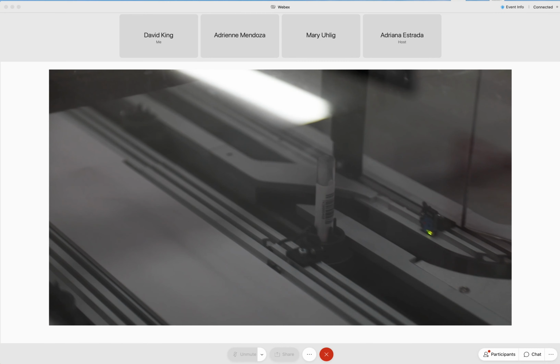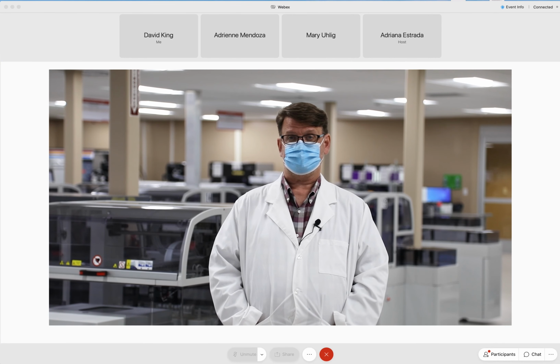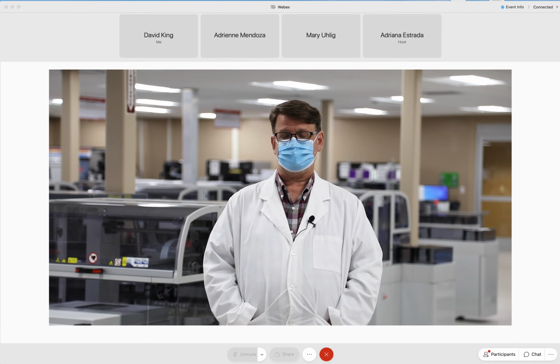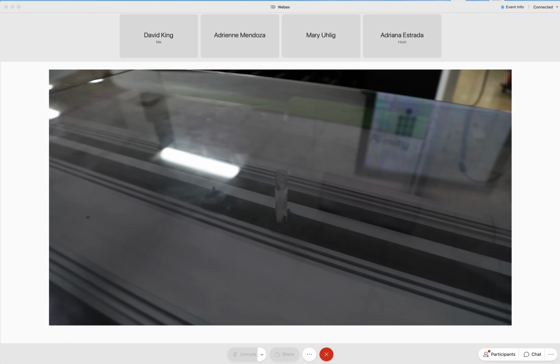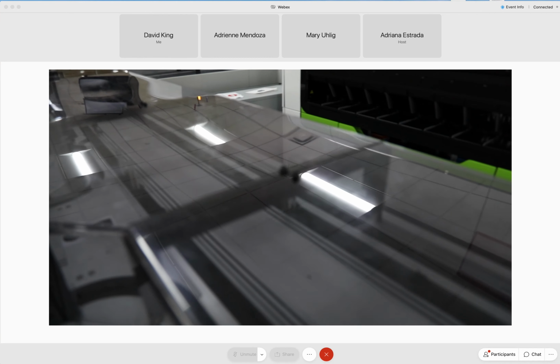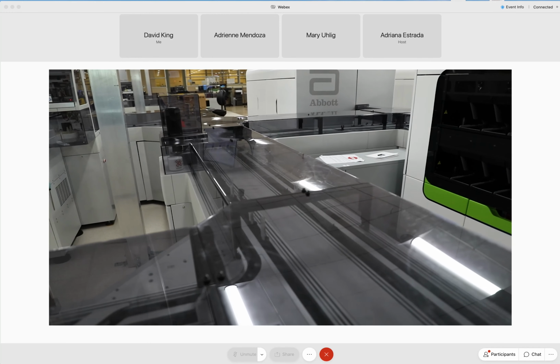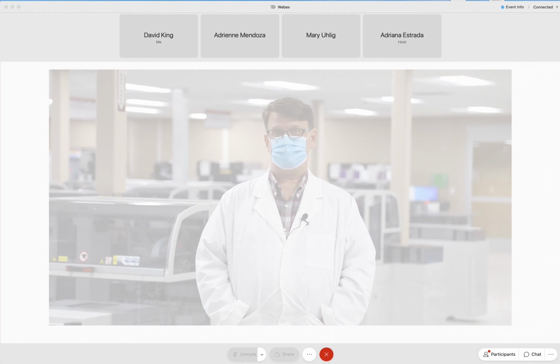And then once we are done with that testing, we also perform additional testing such as determining the blood type and other sort of chemistry testing. And once all testing is done, it goes into our computer system. So for whole blood, we receive the samples during the day and late evening, and we get the testing done in 10 to 12 hours.